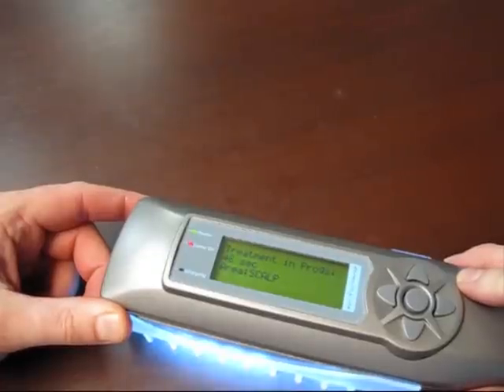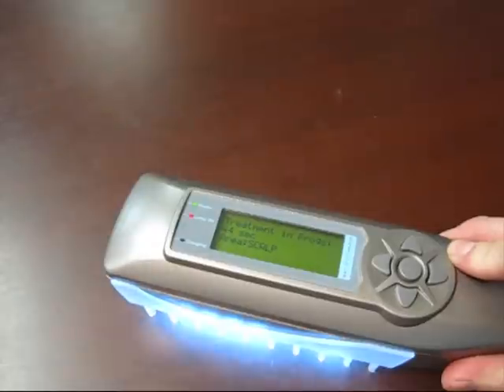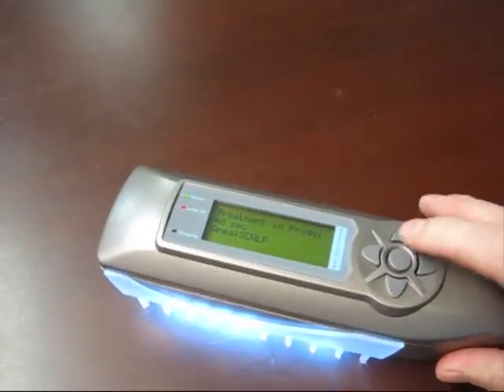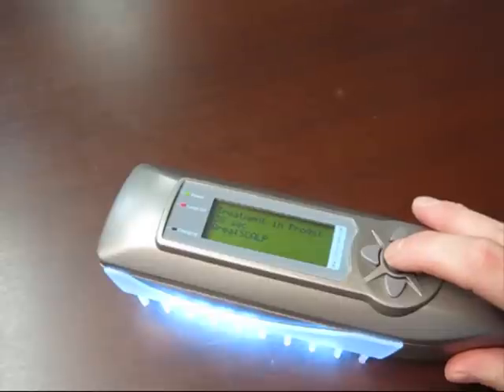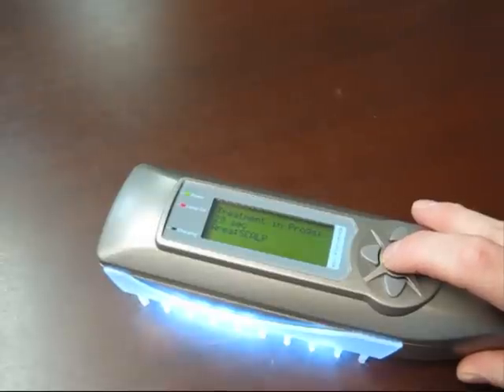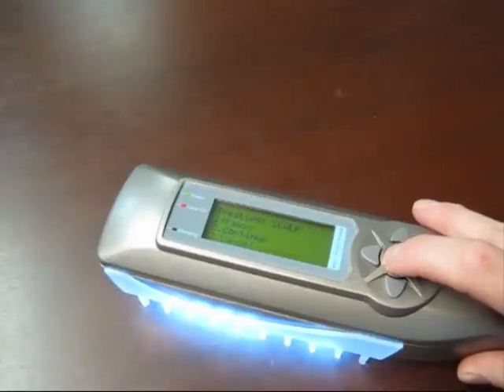So it's now allocating 48 seconds for the next treatment, whereas the first one was about 35 or 36 seconds. And that will continue up to the safe maximum for your skin type and disease type. Once you reach the safe maximum for your situation, each and every next treatment for that patient will be at the maximum. Just cancel that.